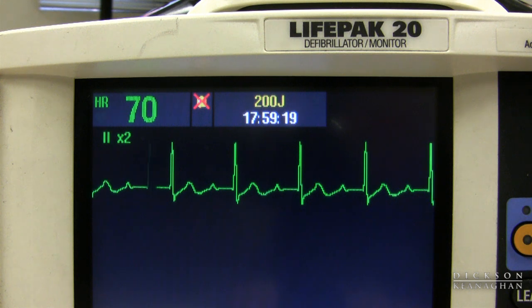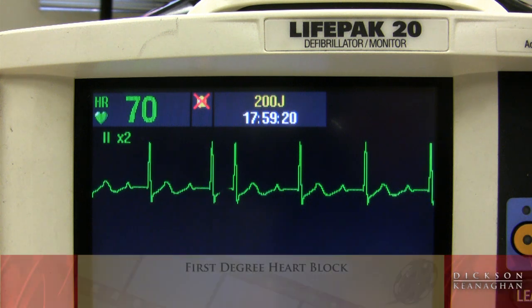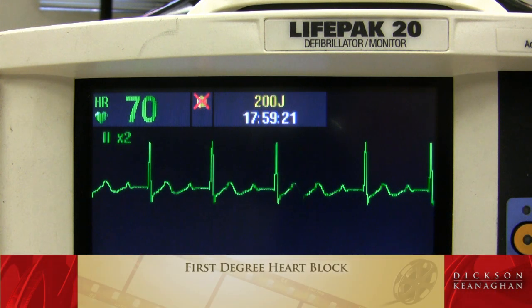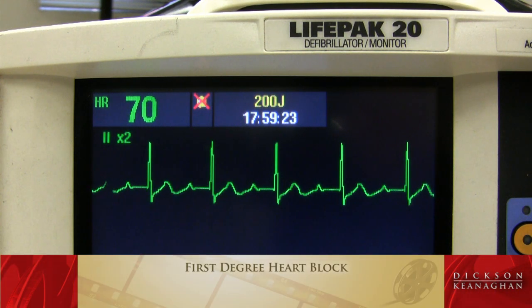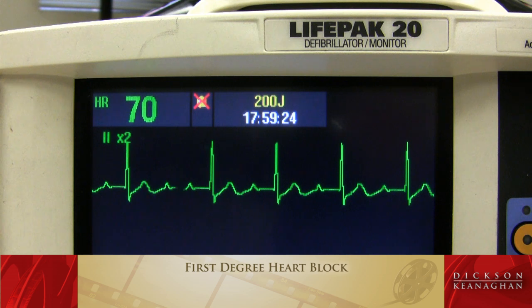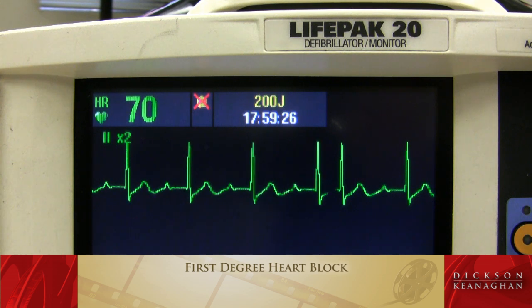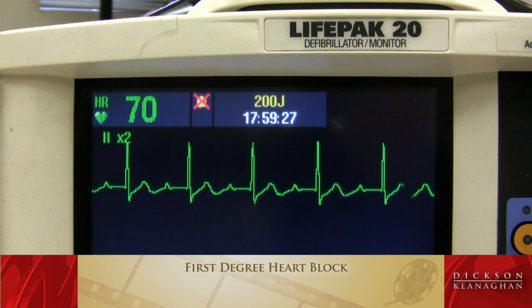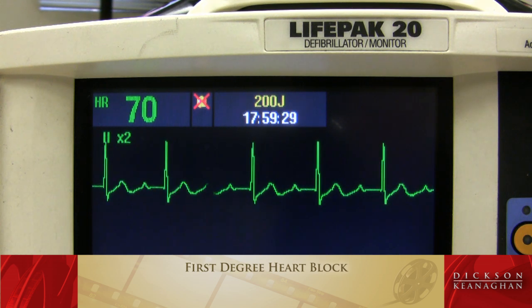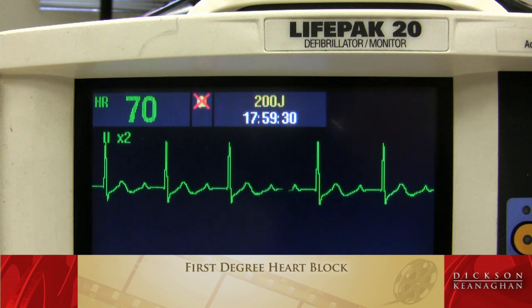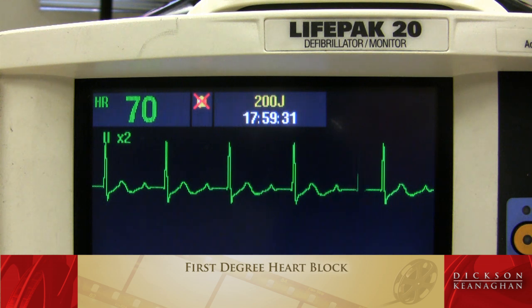Here's a rhythm called first-degree heart block. It is not slow at this time — sometimes heart blocks are slow — but if you notice, the PR interval is greater than 0.20 seconds.